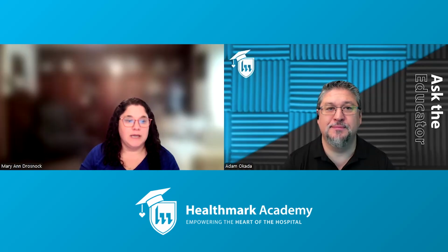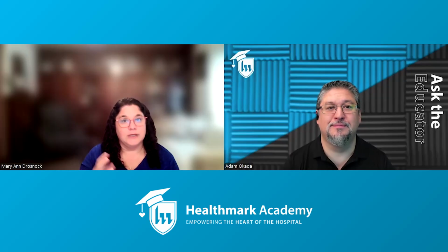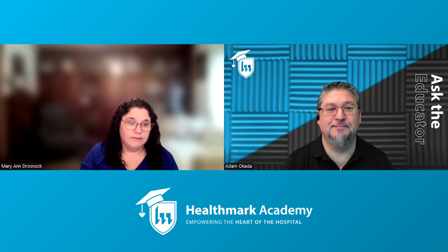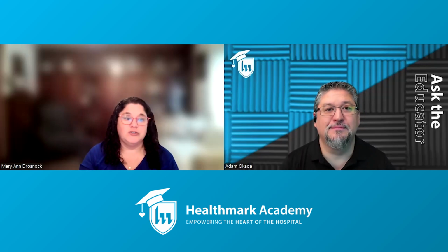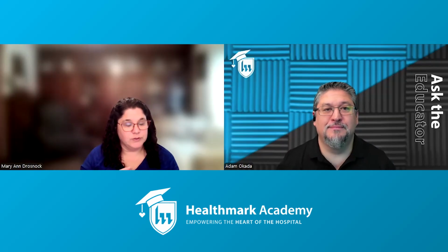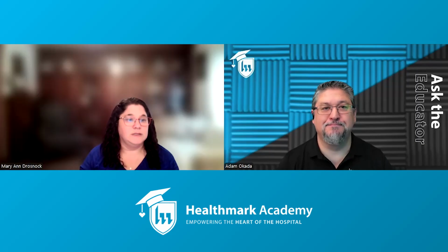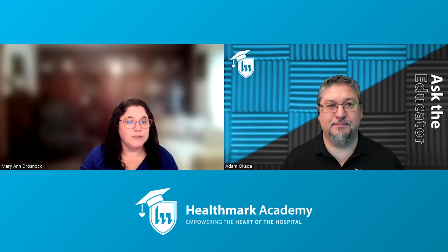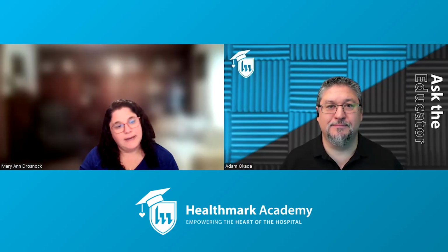But what we're seeing with the action that the FDA has taken is really showing us, or bringing to the forefront again, how they've not forgotten that these duodenoscope and just general endo processing issues still do occur. So I think the two that I want to highlight really are the duodenoscope change. So recently, Olympus came out with a new IFU for the TJF duodenoscopes that removes any mention of a delayed reprocessing time frame.